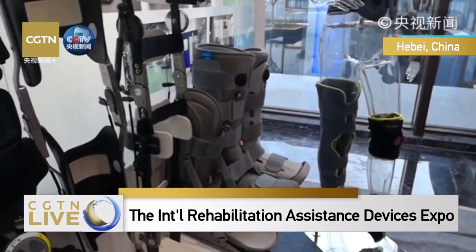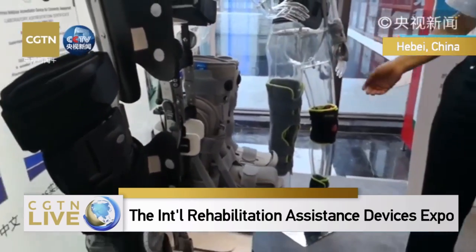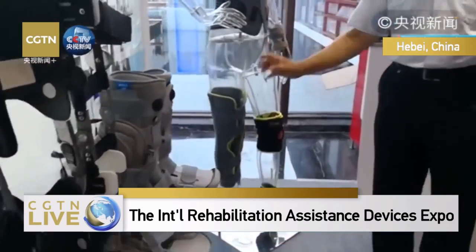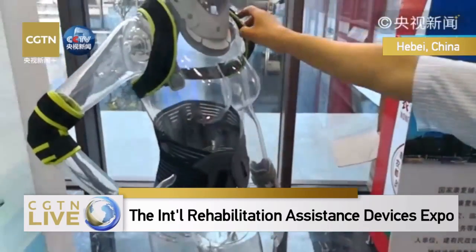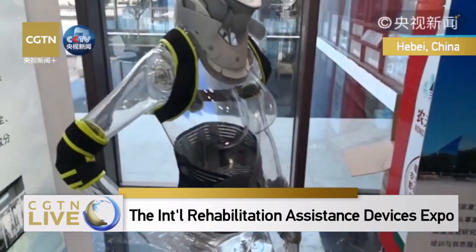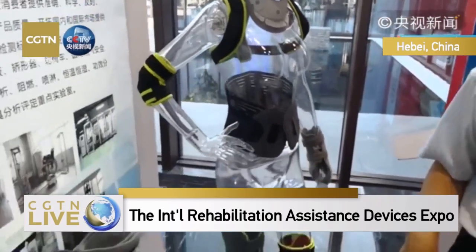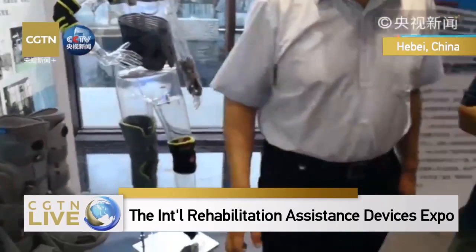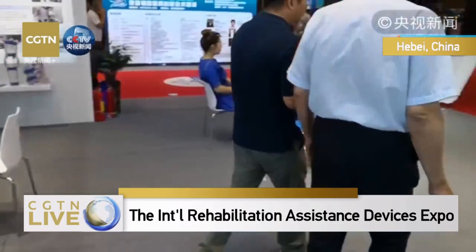These are what we know as supporters, also known as orthotics. This is used on the shoulders. Also one of the 12 categories that we mentioned. Let's go over there.